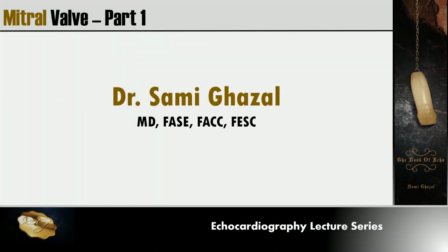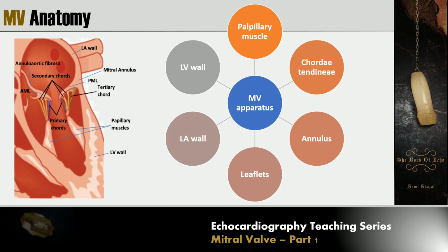Welcome to the Echocardiography lecture series. This lecture will be about the mitral valve. It's part 1. I will speak about the mitral valve anatomy and mitral stenosis. So we'll start with the mitral valve anatomy.